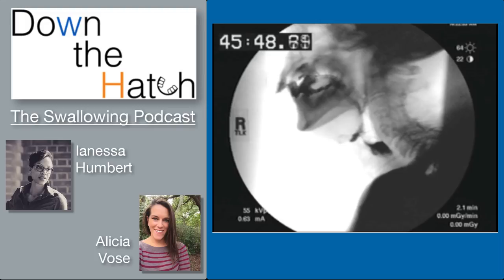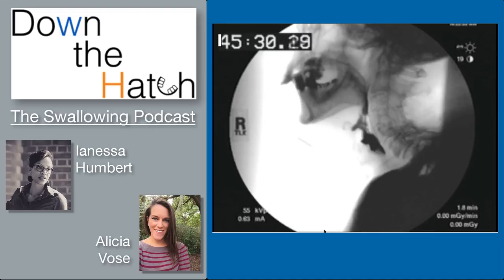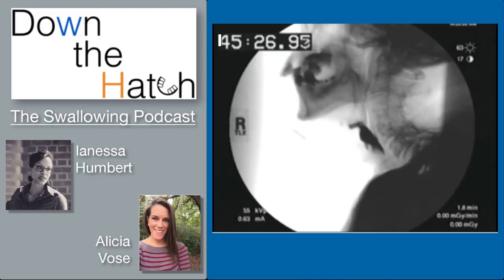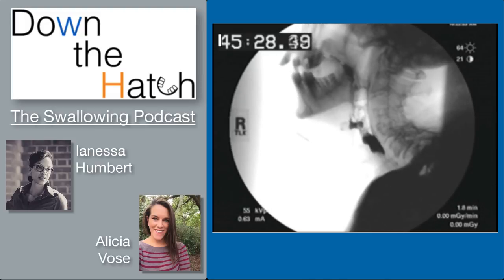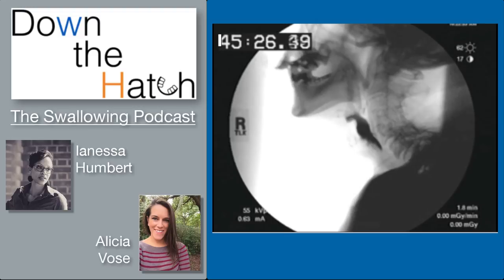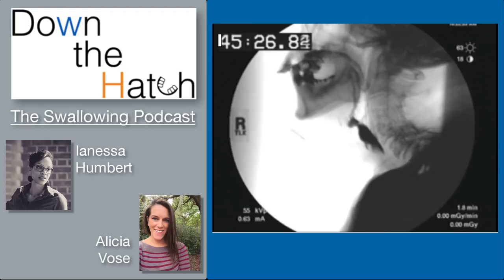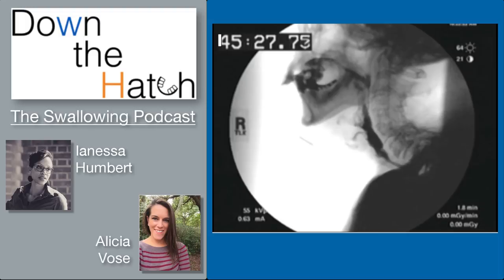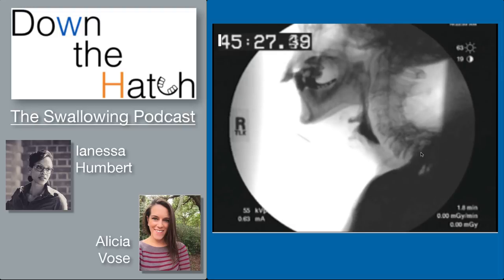This person has both airway protection and bolus efficiency issues. The laryngeal vestibule closure itself was actually fine — it was really about swallow onset relative to bolus position. Watch the UES here: it almost appears like there's some sort of bar or stricture really limiting the amount of opening. Look how much bolus is left behind — it's really pinched off a substantial amount. You can see the bolus sort of go around it and then close.